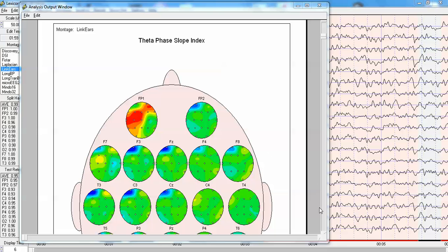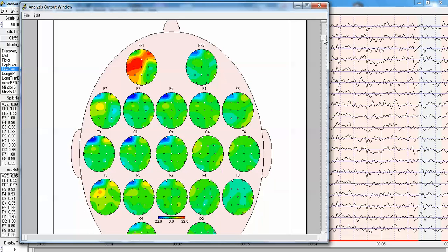The information flow in a patient that has damage to the right parietal lobe is shown, and this is a demo patient, where green means essentially volume conduction. That is, there's no net information flow.